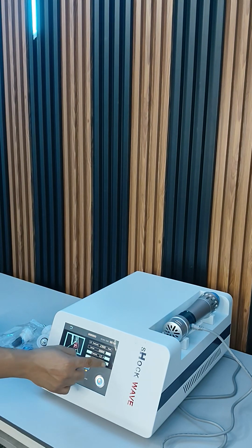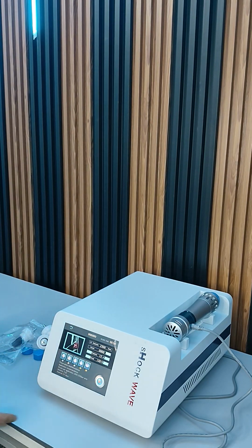If I go to 12, 14, 15, you can see it is automatically varying the maximum. 15 Hz is too much, and at that frequency the maximum energy you can take is 130, because going beyond that may damage the product and the joint also. So this is automatically adjusted.